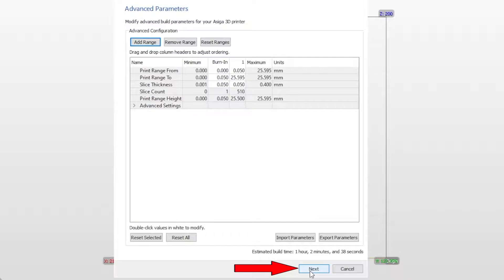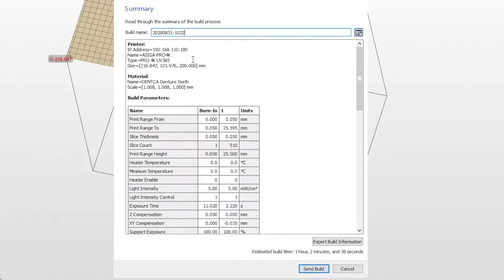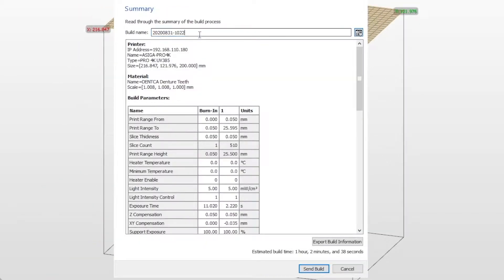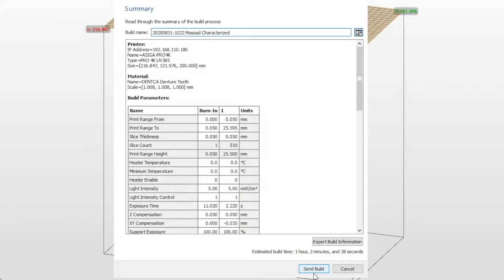Click next again to view the summary page. Located on the summary page is a section to name the build you're about to send to the printer. After naming the print, press send build to send the job to the printer.